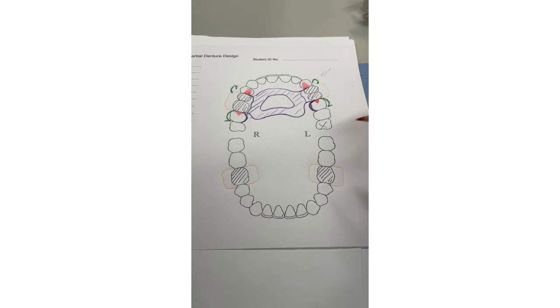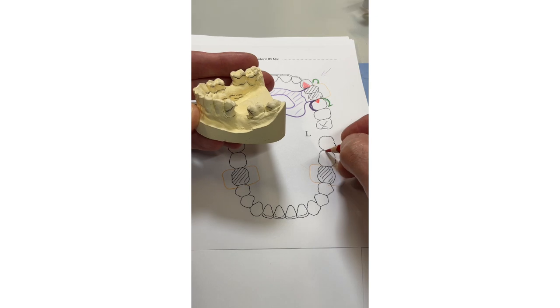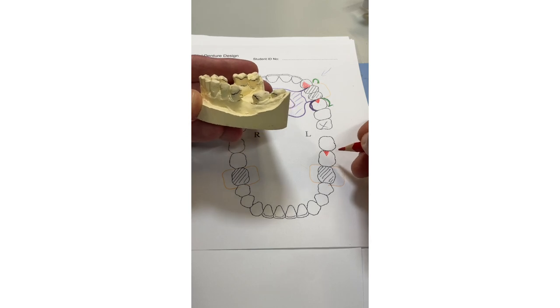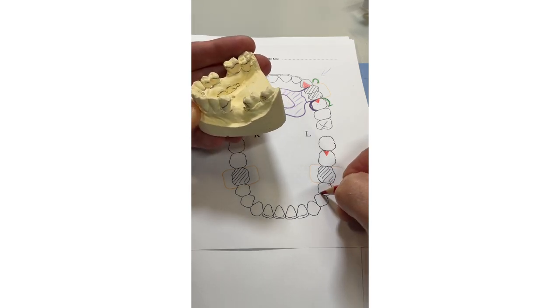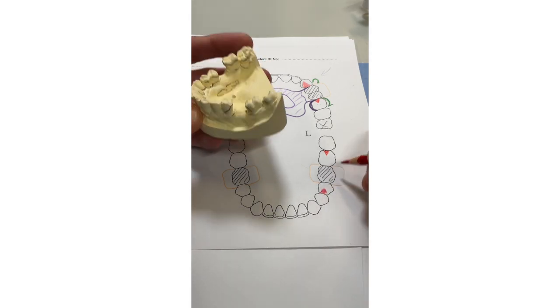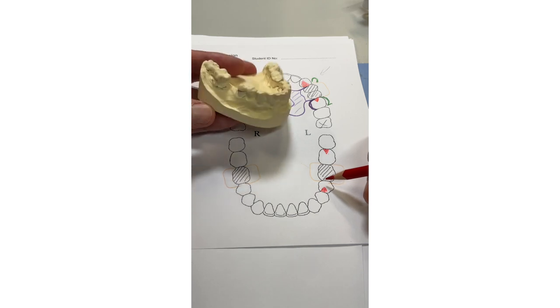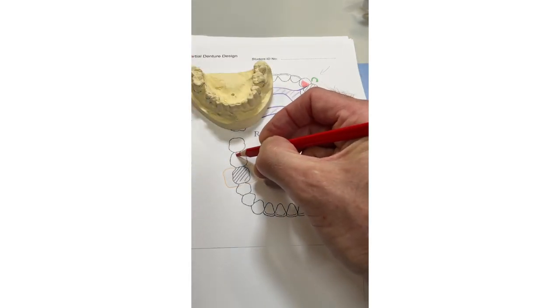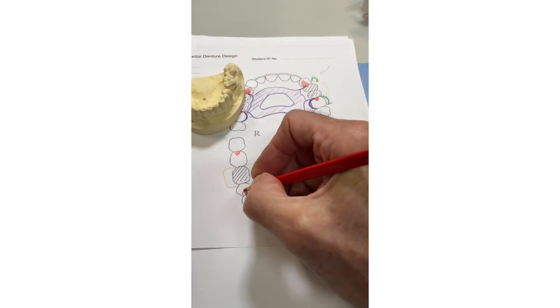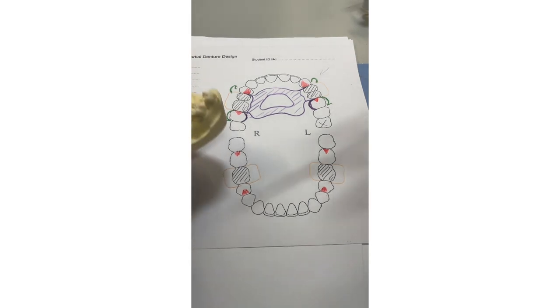Now support the short span saddle. The molar here is mesially drifted and lingually drifted, so if you don't load the tooth axially you're not doing maximum support. Load this one distally because of the angulation, and the five is drifted back a bit so load it mesially with the rest. You've now got axial loading through both those teeth — these are dependent on occlusal clearance but we're assuming it's okay. On the other side the tooth has also drifted slightly, so rest distally and the premolar gets a mesial rest for safety.